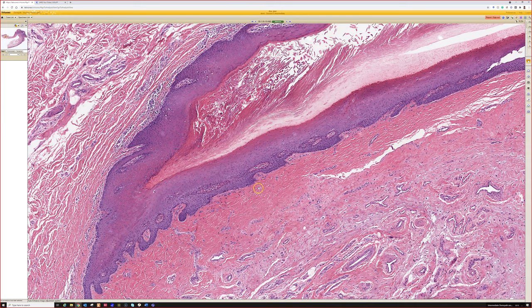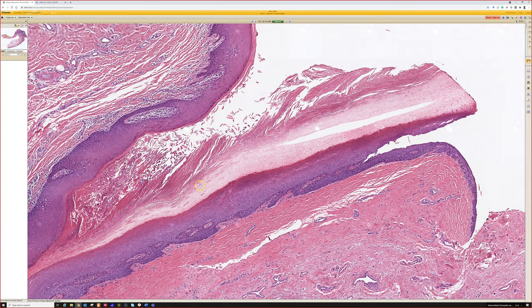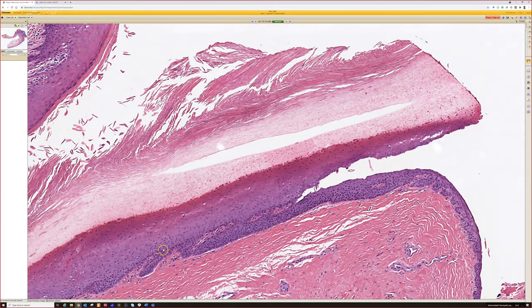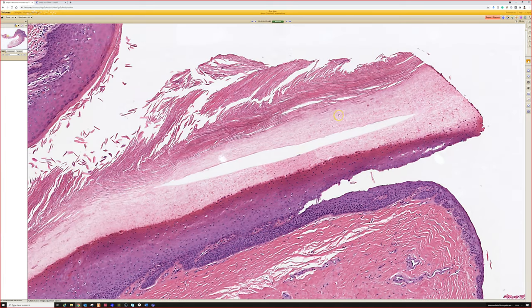So there's the nail matrix, and then from that we can see the keratinocytes develop into a thickened compact layer of keratin, kind of resembling stratum corneum but more dense, that sticks to the underlying epithelium, which the matrix transitions into nail bed epithelium at some point in here. And then this is the nail plate on here, the part that, for any of you who are beginners out there watching this online, the nail plate is the part that grows and that we clip at the ends, or that we paint, if you're into that.